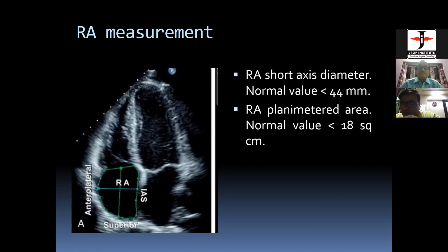So one more thing. In every echocardiography report we see, everybody measures E amplitude, EF slope, EPSS. Everybody mentions it, but nobody talks about it. In whatever talks I have gone to, everybody just lets it go by historical importance. So I just wanted to know what is the historical importance. Really, there is no necessity of measuring E amplitude, EF slope and EPSS. These are of historical importance only. You might as well omit that when you do your echocardiography in your hospital.